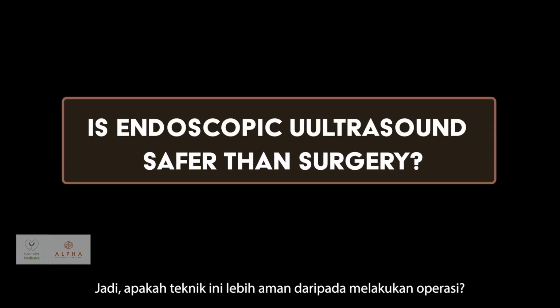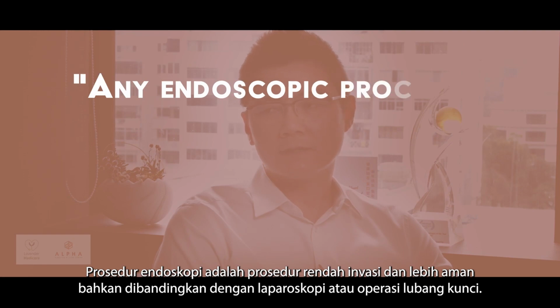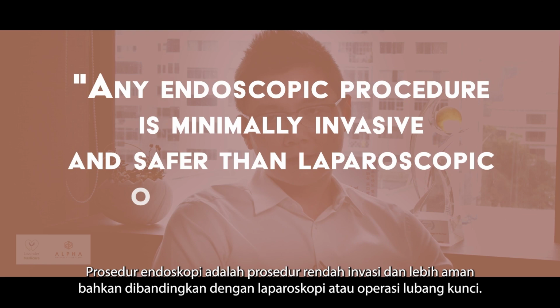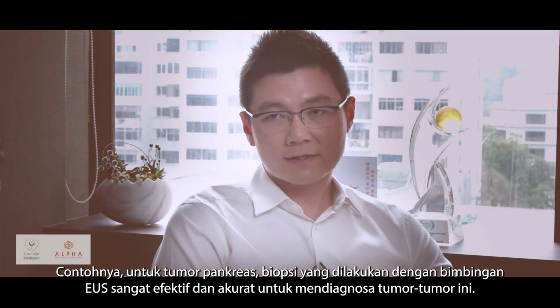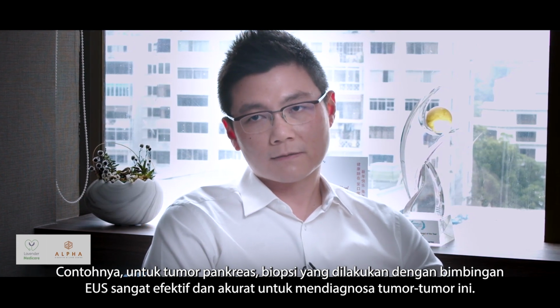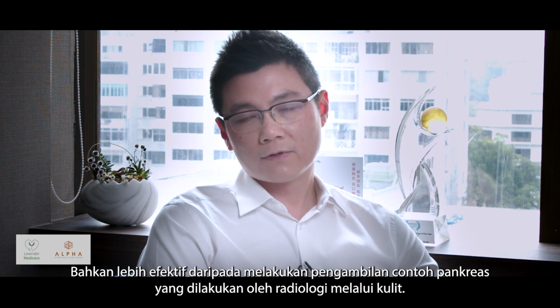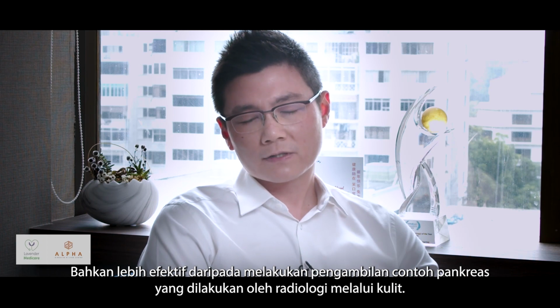So EUS, it's considered safer rather than to do surgery and to go in? Oh, definitely, yeah, definitely. Any endoscopic procedure is minimally invasive and will be safer than even laparoscopic or keyhole surgery. But how effective is it? It is very effective. For example, for pancreatic tumors, EUS guided biopsy is the most effective and accurate way of diagnosing these tumors, even more effective than what the radiologists do by sampling the pancreas from the skin.